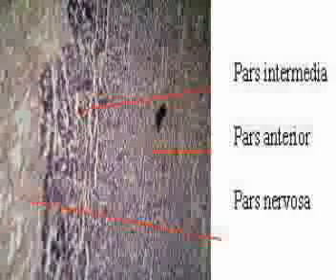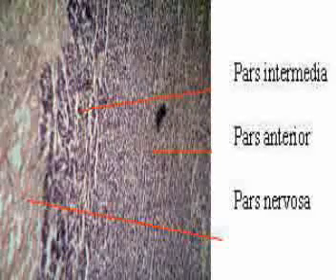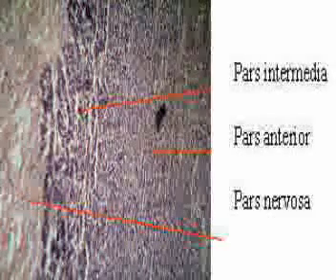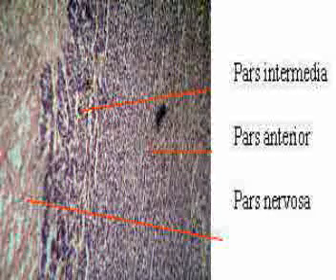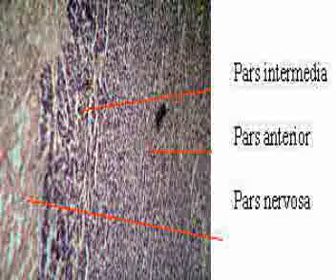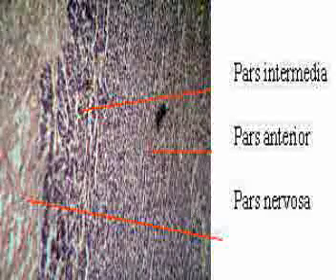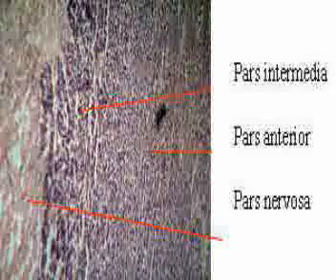Differential diagnosis. The very compact organs like liver, spleen, and lymph nodes can be confused with the pituitary gland. Firstly, liver has plates which radiate like the spokes of a bicycle wheel. Pituitary gland has cells which form cords rather than plates. Spleen has distinct red and white pulps, and lymph nodes have distinct cortical nodules with light staining centers called germinal centers.